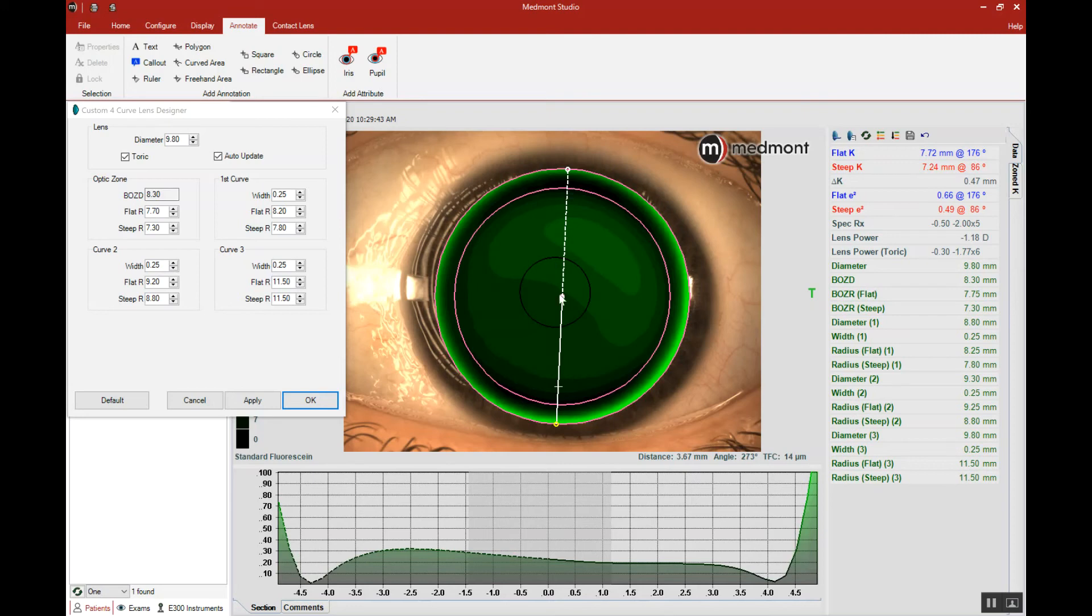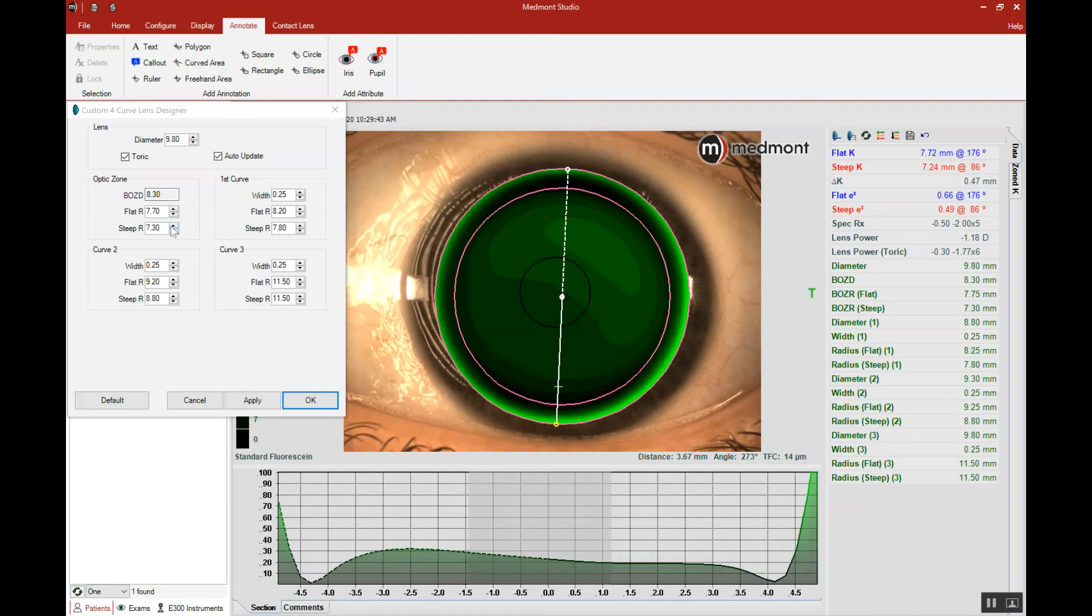In the steep meridian, you'll notice our lens is landing down, and we desire to have a small channel running through the vertical meridian to promote good tear pump, good tear exchange, a healthy rigid contact lens fit. So our lens across the steep axis is too tight. Let's flatten the steep meridian.